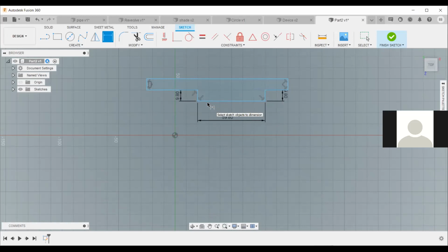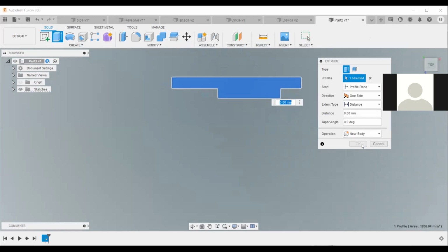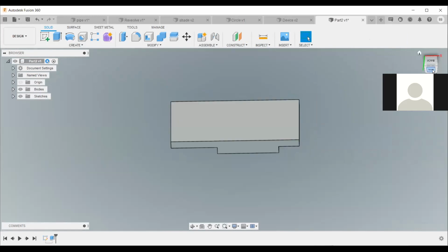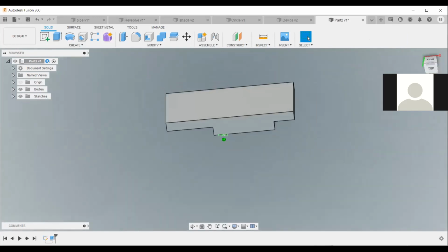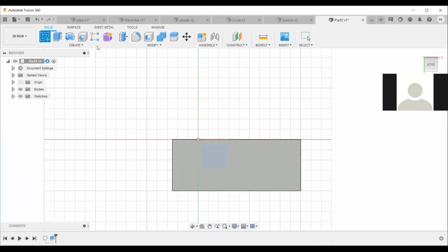Meona? Hello? Hello. Yes, meona hiyo. I've given it 0.2 some clearance so that it can fit. Yeah, so finish. So then you'll extrude it. It was 50. Yeah, so 50 is okay. Mnaona? Yeah. Okay, then remember we were having those circles.